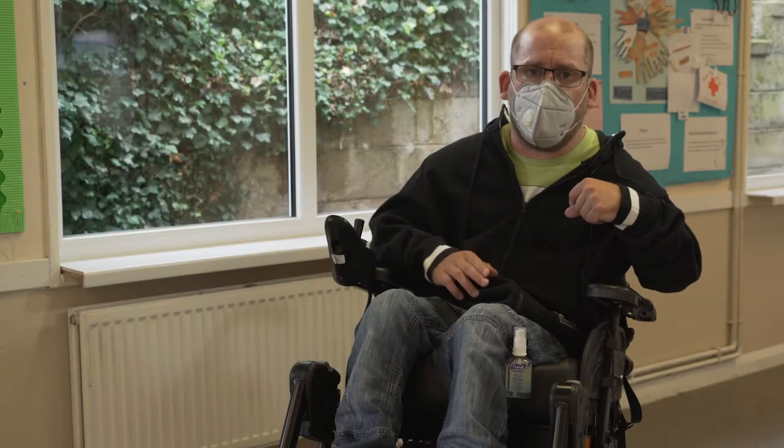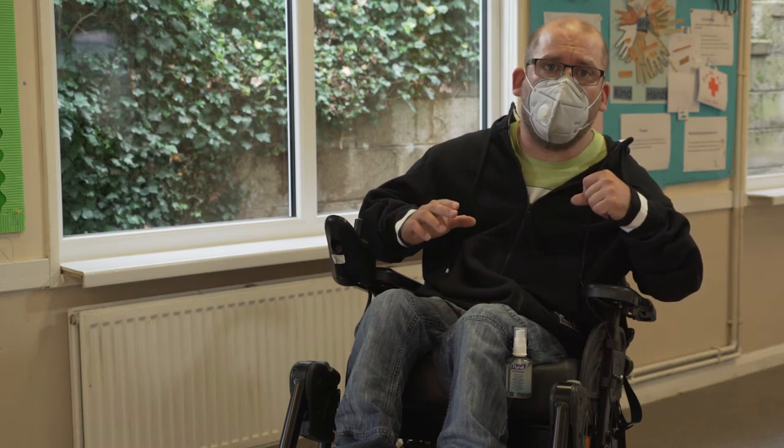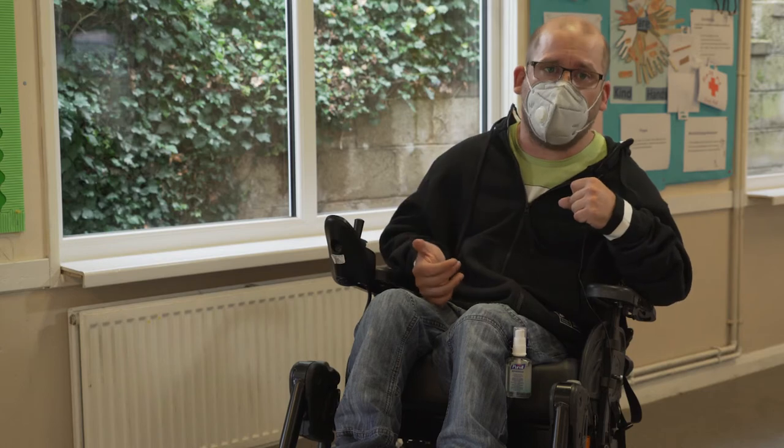Whatever the gradient and how steep a drop curb or a ramp is, it is important to feel balanced in your wheelchair and comfortable while driving.